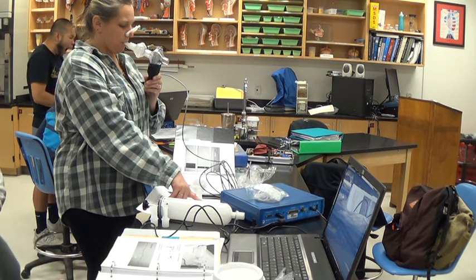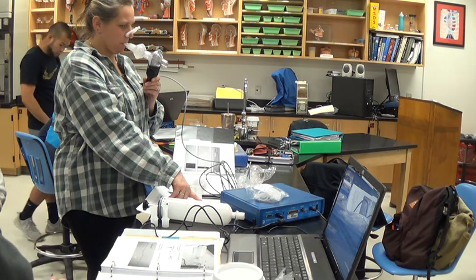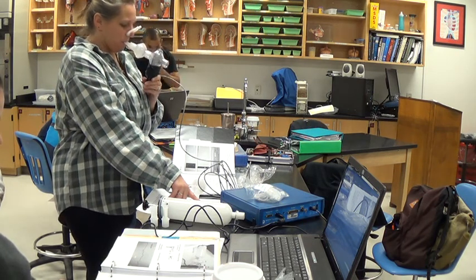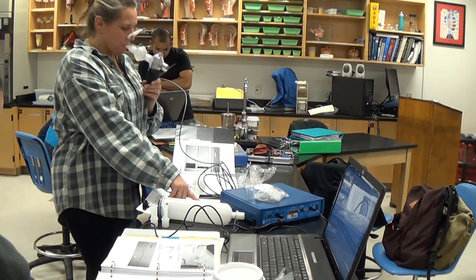So you're going to read it until delta reads. It should be giving you the PP value though. Oh, and then it says read the PP value. Yeah, but we have delta, but there's no PP. We can open another one and make it PP. So yeah, that's what we've got to do.